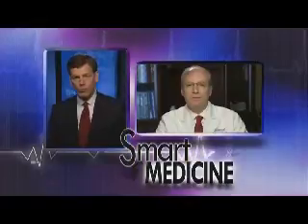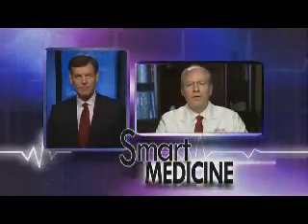How are they better than older monitors? They're better than older models in a number of features. Primarily, they're able to provide a lot more clinical information for patient care that we used to never get before. The original devices that came out were able to communicate through a telephone line and would provide some very rudimentary data for us in terms of just the overall basic battery life of a device. But now with the device therapy that we get, the information really provides us an incredible amount of management in terms of the volume status of a patient, not just in terms of their heart rhythm, but their overall well-being and their overall clinical status.